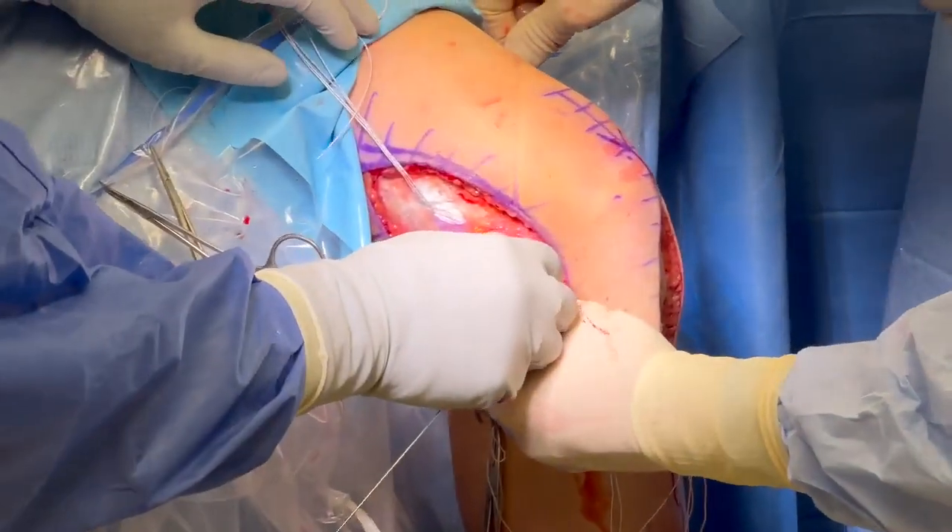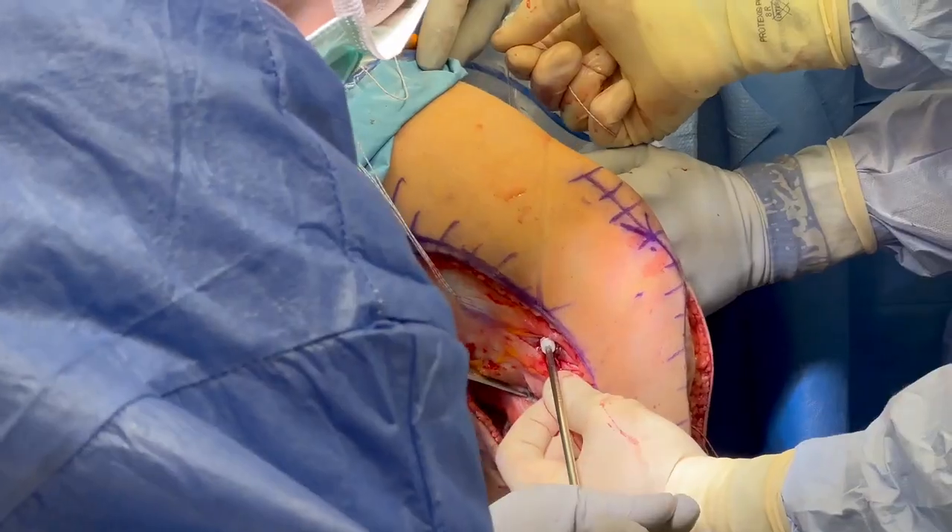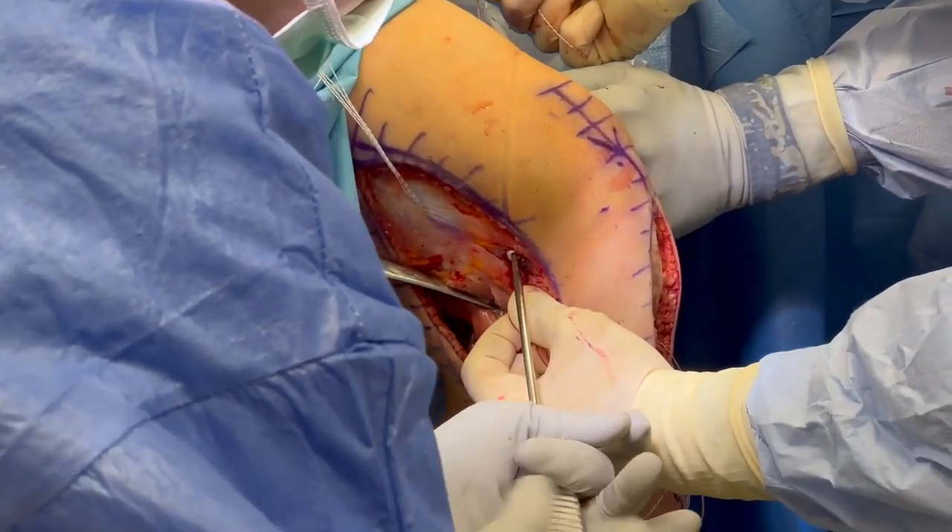The FCL semitendinosus autograft, which was whip stitched, is pulled into the femoral tunnel and fixated with a 7 by 20 millimeter bioabsorbable screw.